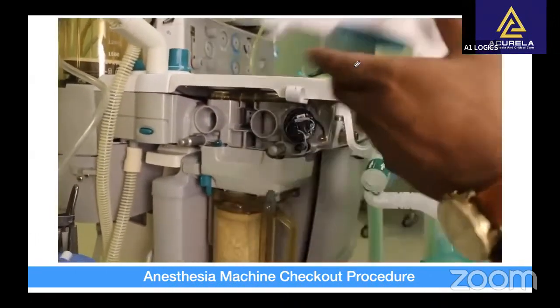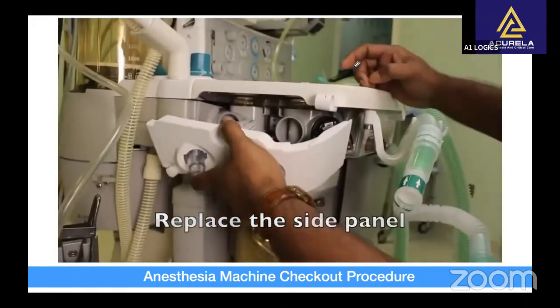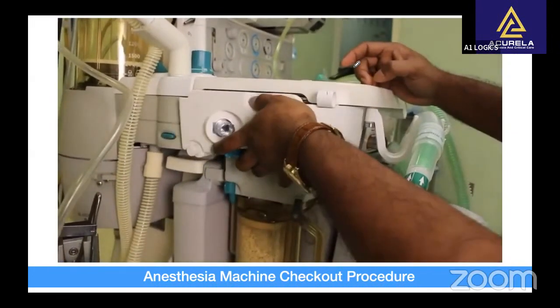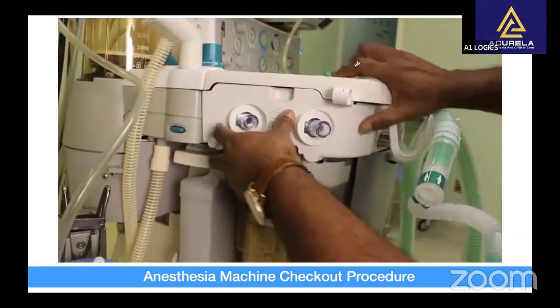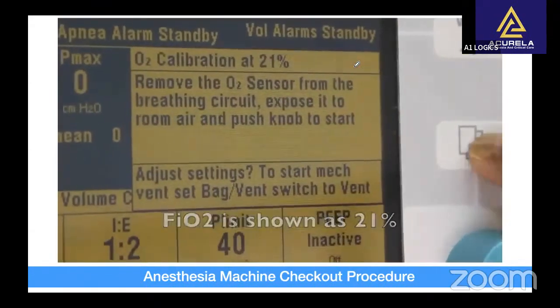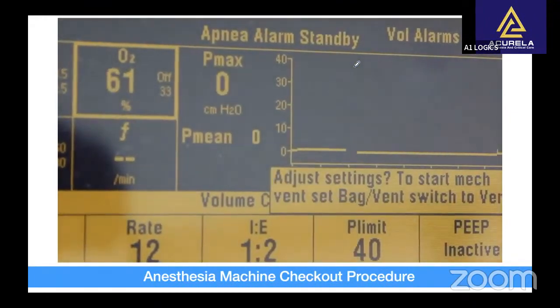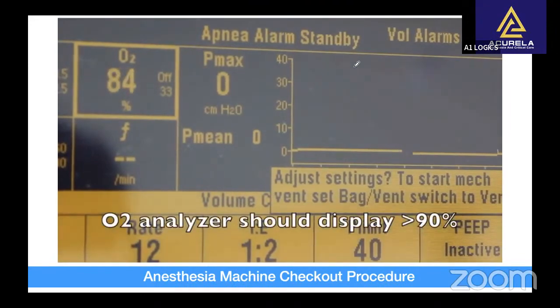Now replace the panel carefully. The oxygen analyzer is calibrated at 21%. Now increase the FiO2 by using oxygen flush and see if the oxygen sensor reads above 90%.